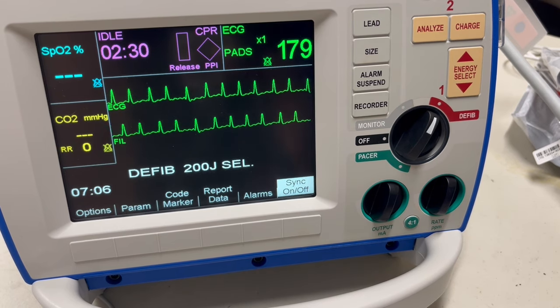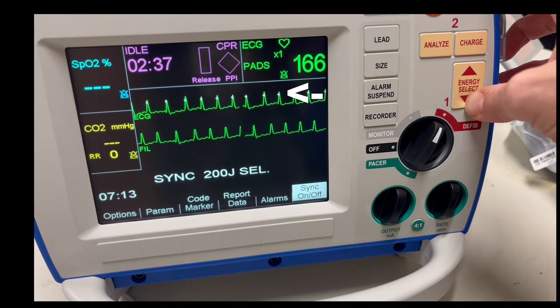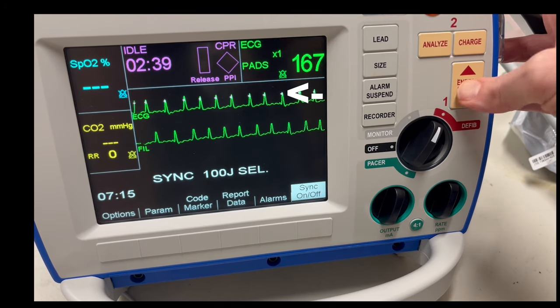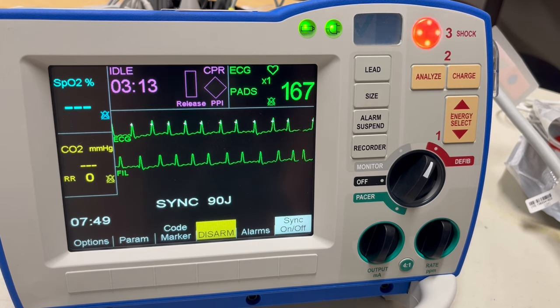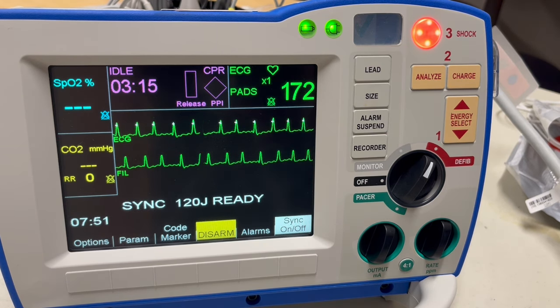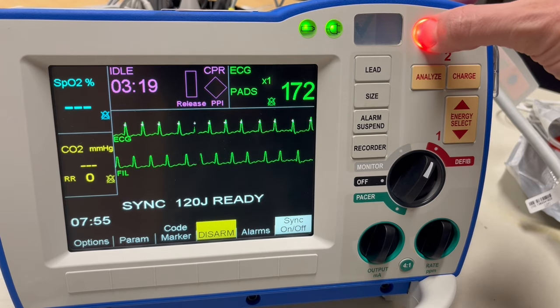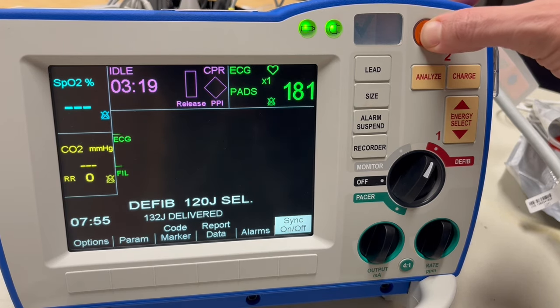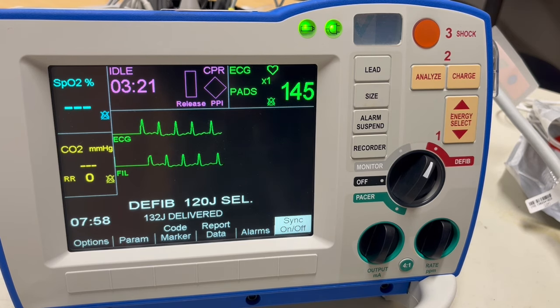To cardiovert a patient, press the soft key on the bottom that says Sync. You will see white dots marking the R waves. Next select the joules the provider wants, then charge the device and press and hold the shock button. By holding the shock button you are helping the device deliver the shock at the right time of the QRS interval.